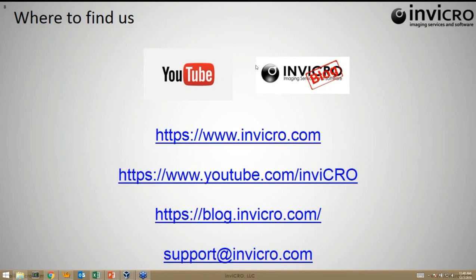So we did have a couple of questions, or one question in the chat regarding clinical approval. So VivoQuant can be used for clinical analysis. You would need to perform your own internal validation of your workflows. It's not, however, approved for diagnostic purposes, strictly for research. And another one, when will VivoQuant 3.0 be available? It's available currently on VivoQuant.com, as well as within your current installations of VivoQuant. If you go to Tools, Update Check, it will recognize that your version is out of date and allow you to download and install the new version.